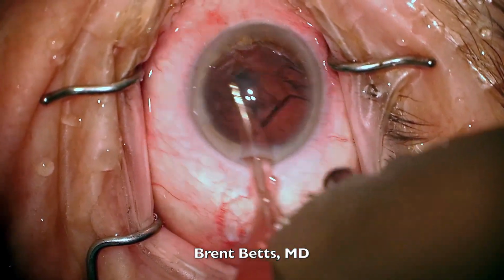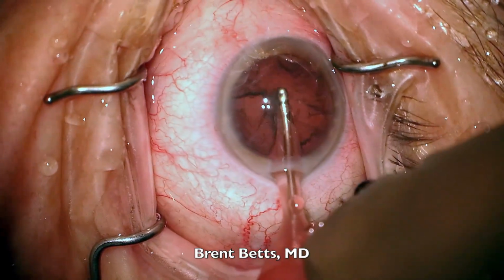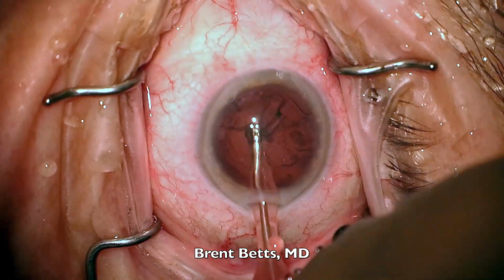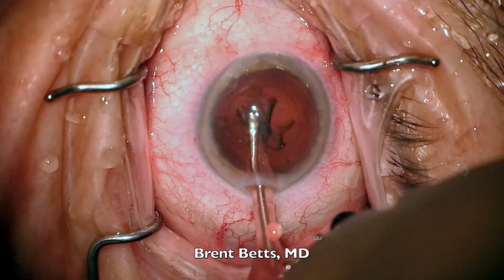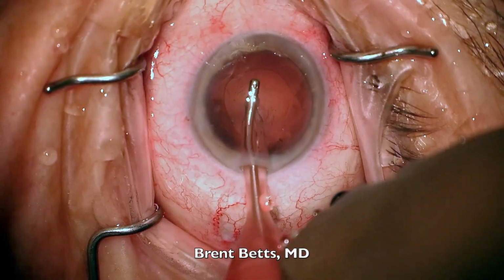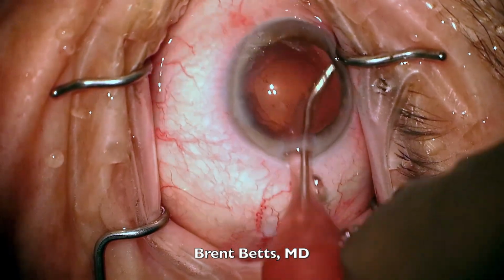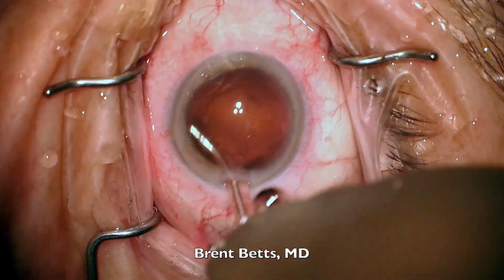I grasp the edges of the cortical material from the capsular bag, and with a foot pedal, I build vacuum power and bring the cortex to the center of the eye where I can suck it out. You can see the capsular bag's much clearer at this point. I'm polishing the underside of the anterior capsule here.